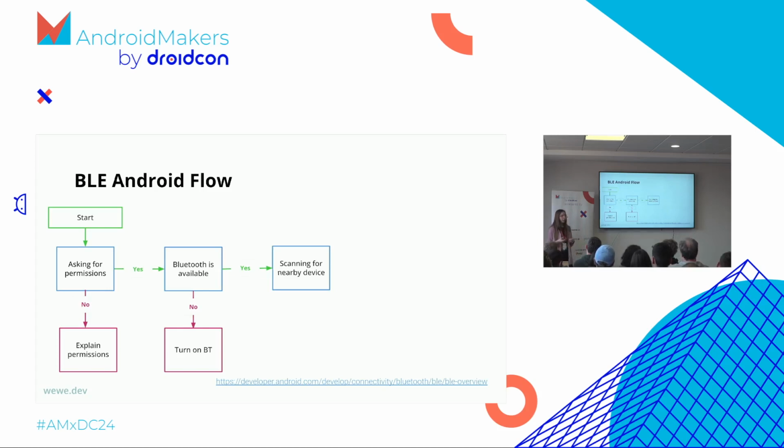And here we have a few things again, because for some reason the device couldn't be found. We need to explain to our user why it wasn't found. When we think about scanning, we need to consider the time, because we shouldn't give too much time for scanning, because it will drain the battery. However, when the scanning time is too low, our external device in a noisy environment couldn't be found. Hopefully, we find our desired device.